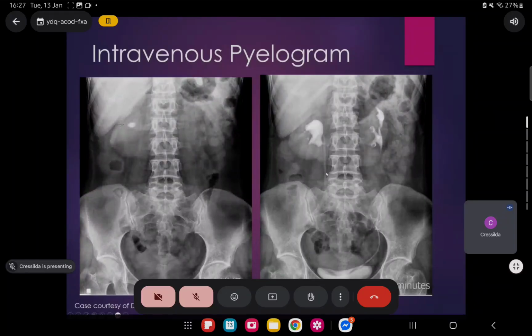And then here, this is a patient who underwent the same particular procedure. And then you do notice, if I'm not sure if you noticed, but in the previous study, the cortex would be rounded up here. However, you have a connection here. So this is a patient with a horseshoe kidney. That is where the inferior poles of both kidneys are fused together like a horseshoe.